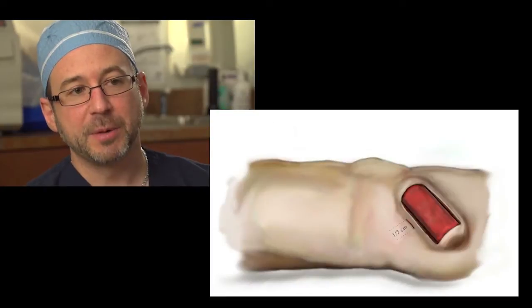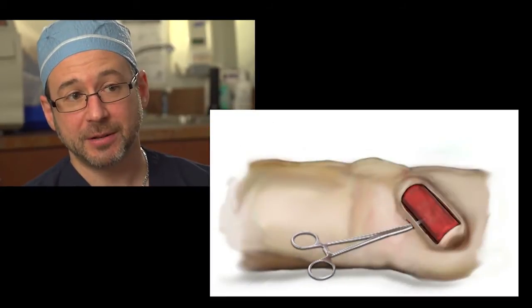The procedure is very handy because if something is wrong and the patient cannot get adequate dialysis because the flow was slowed too much, you can either stretch the band or take a bigger balloon and break it. It is completely undoable, and that's one of the things that makes it beautiful.